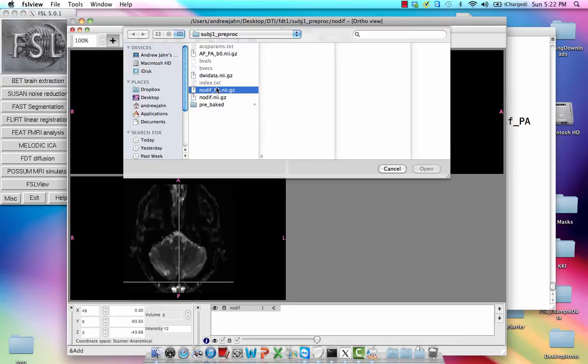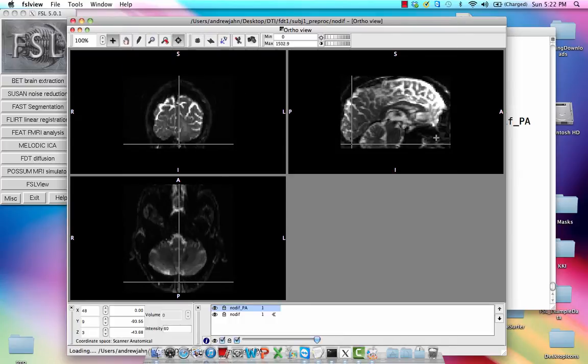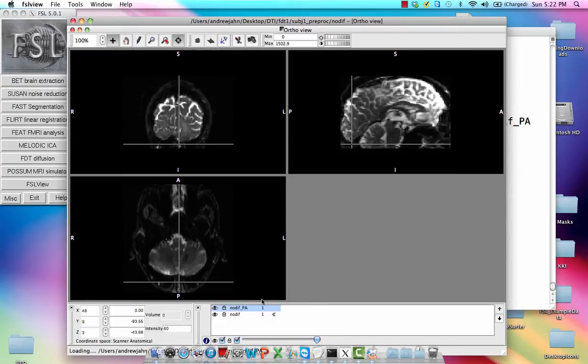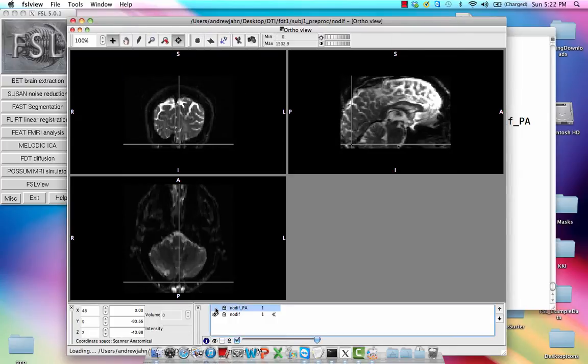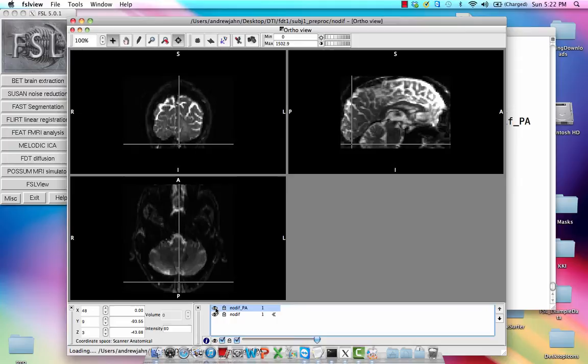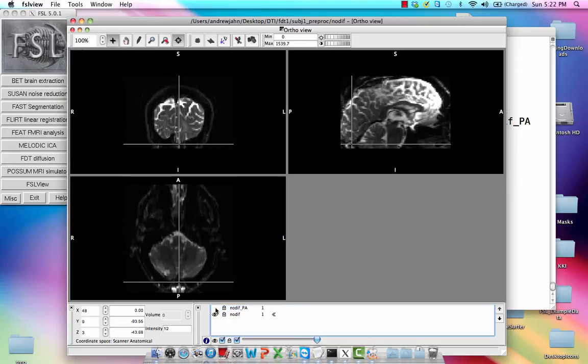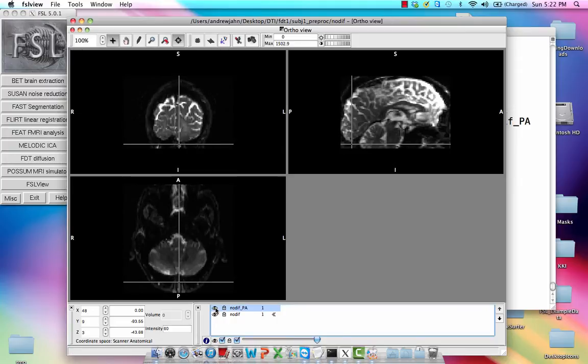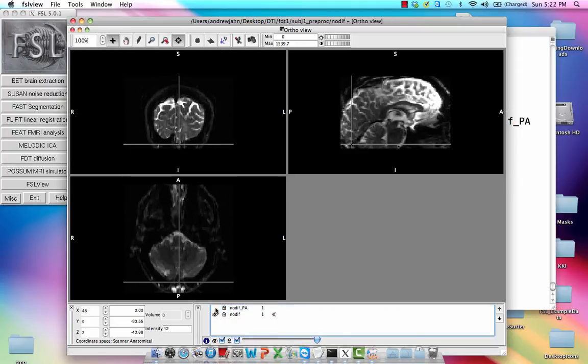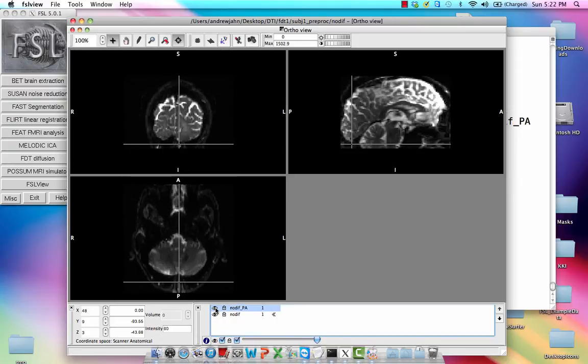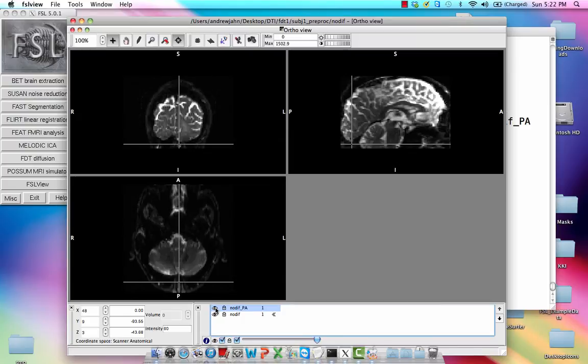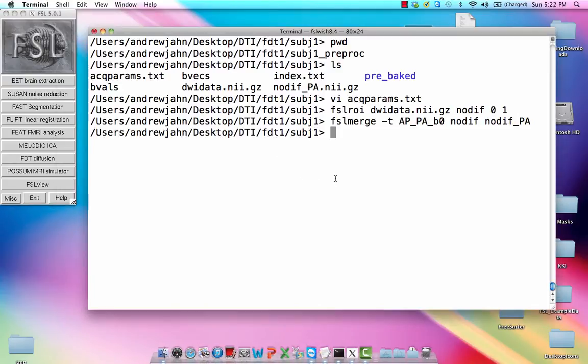We can add our no-dif PA, and we can toggle between the two by double-clicking on this eye icon right here. And you'll notice that between the two, there does seem to be a lot of variability. Essentially, both of these give different information about susceptibility artifacts during the DTI acquisition, and we're going to try to correct for those.